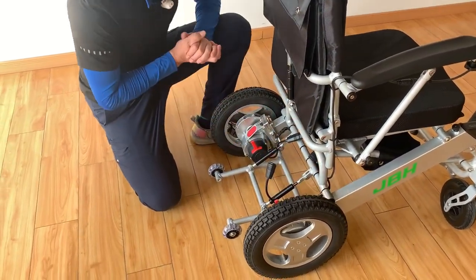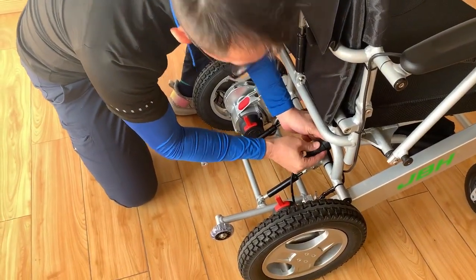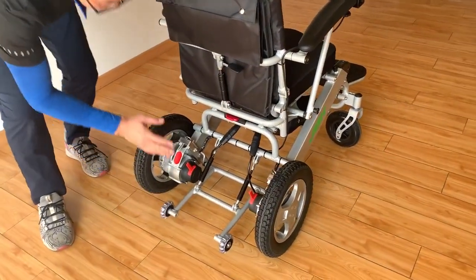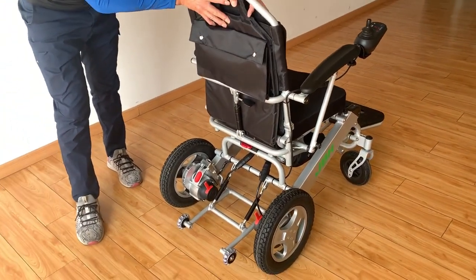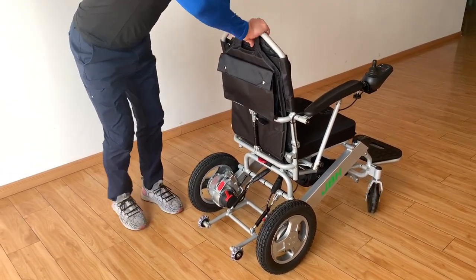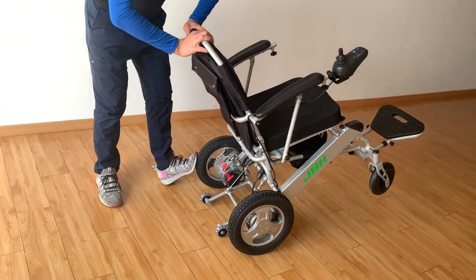Then slide it back in, push the pin back to lock it for safety, then connect the wire — and it's all set. Also, look at the anti-tilt wheel, which is really important for protection when you go up a hill. We have two dampers here that create a shock absorber function when you come across a certain urgent situation — it's really safe.